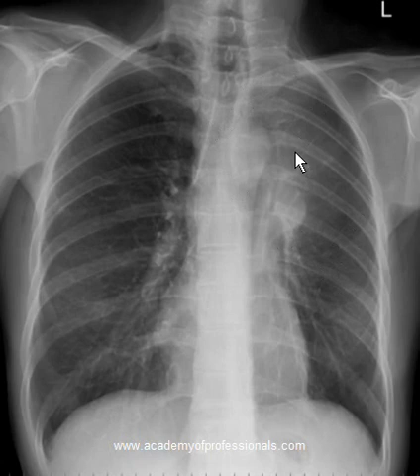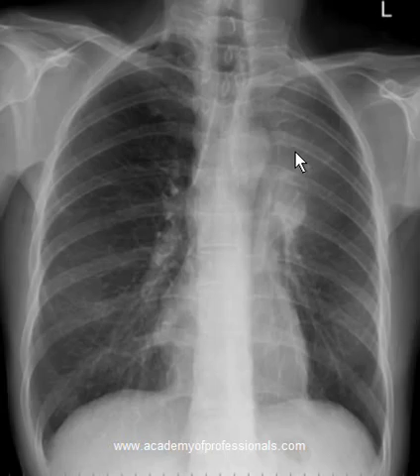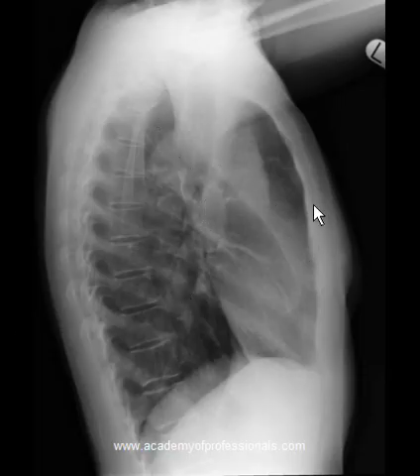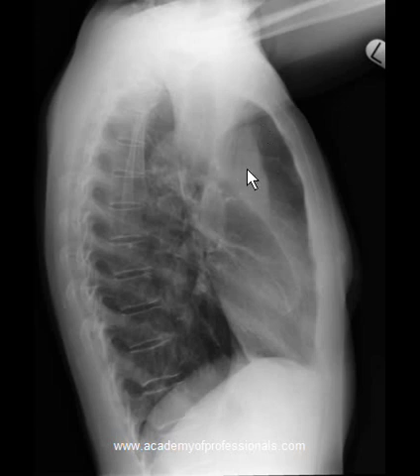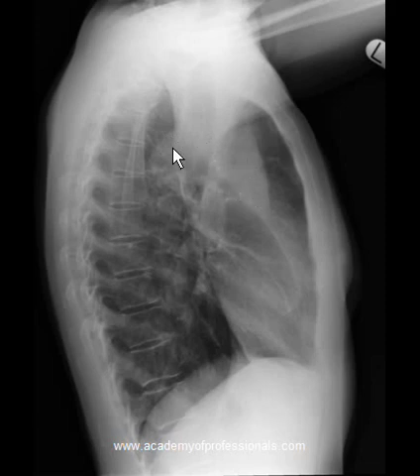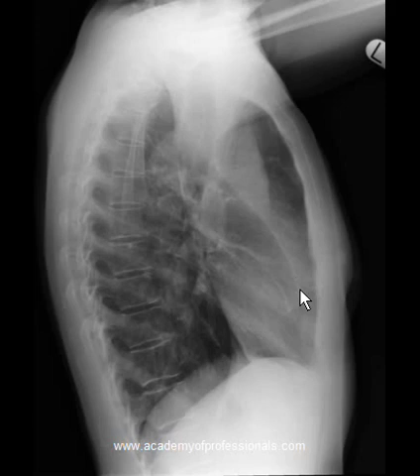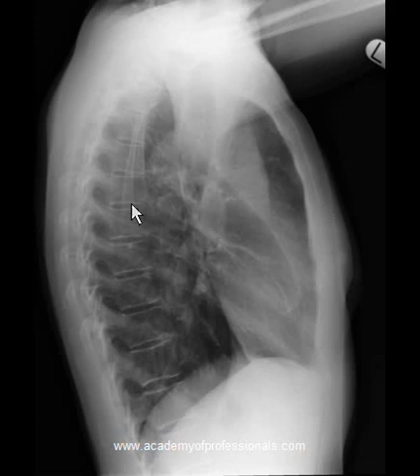The lateral view often makes life easier, so let's see the lateral view of this patient. The lateral view is very diagnostic. You can see a sharp line here and the tissue here, with a difference of densities. This tissue belongs to the right lung. This is the aorta — ascending aorta, arch of aorta, and descending aorta. This is the oblique fissure, which belongs to the left lung. It should normally be somewhere here. This is a very typical picture of left upper lobe collapse. The left upper lobe collapses from the back towards the anterior chest wall.